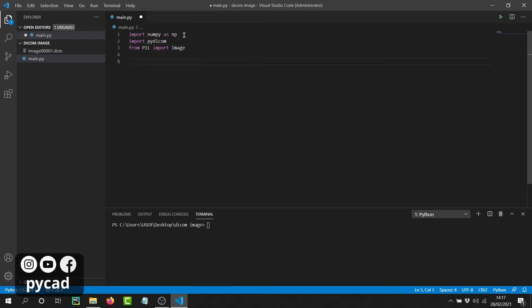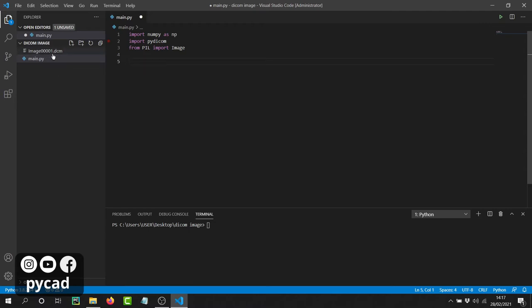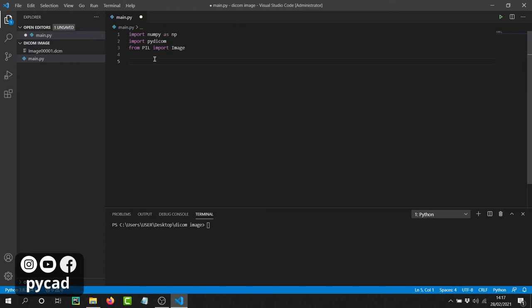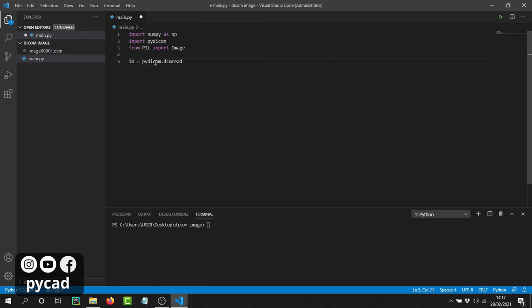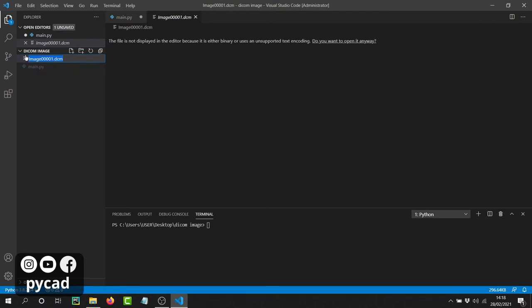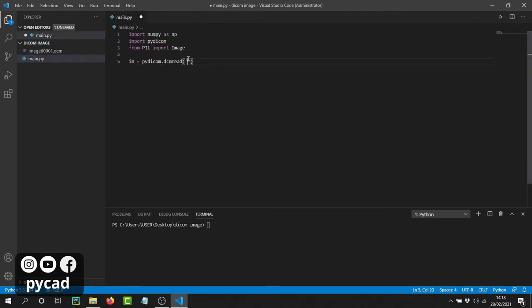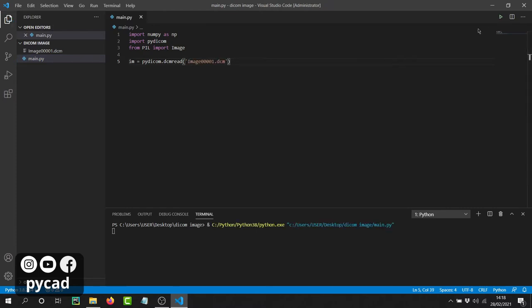Now after doing this, we have to open the image we want to use. In my case the image is already in the same folder as my project, so I only need to write the name of the image. If your image is in a different location, you need to provide the full path. I'll store it in a variable called `im`, then use `pydicom.dcmread()` and pass the filename.